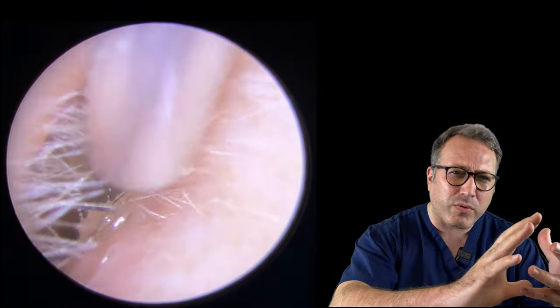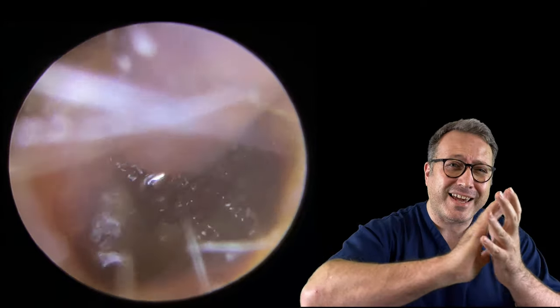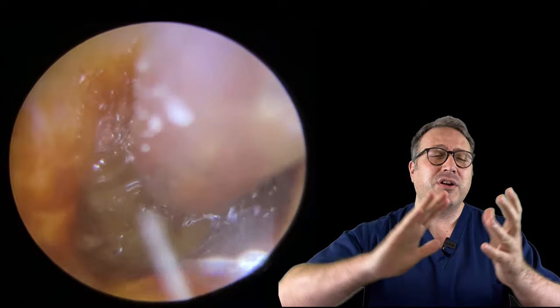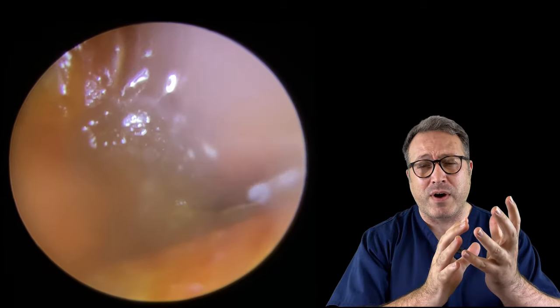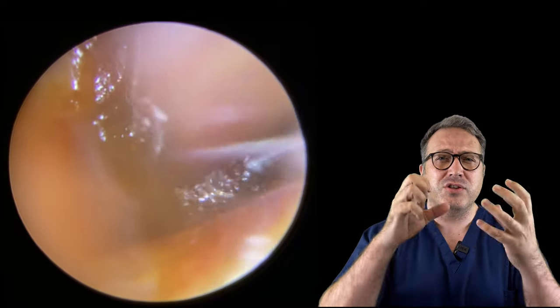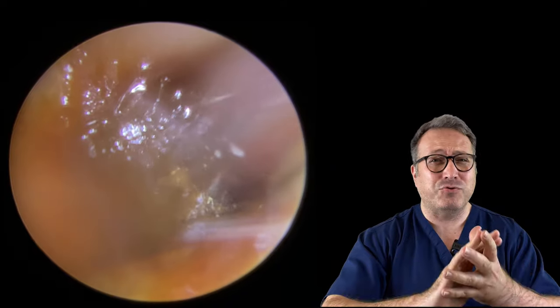It's pushed the wax all the way down the canal, right down on top of the eardrum, actually impacting it against the eardrum. And the worst thing that could have happened is the tissue paper has dried all the oil and all the moisture out of that wax. So we end up with a hard solid wax lump actually physically stuck to the eardrum.